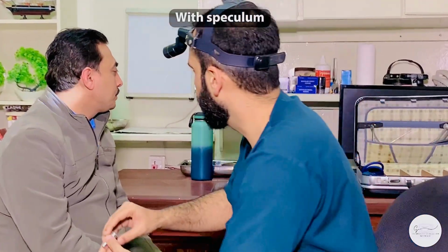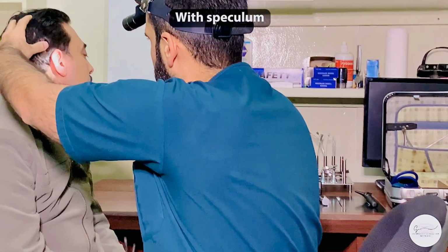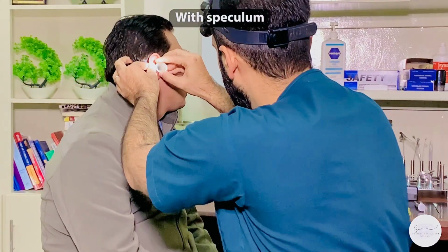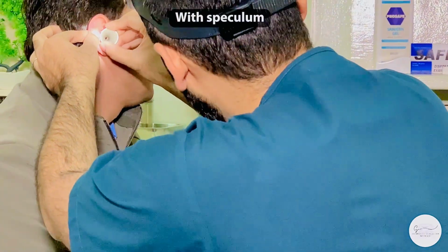This is examination without a speculum. After the examination without a speculum, you need to take an appropriate size ear speculum and you need to introduce it in the external auditory canal. And this movement should be a rotatory movement. You should be gently rotating it while seeing inside.